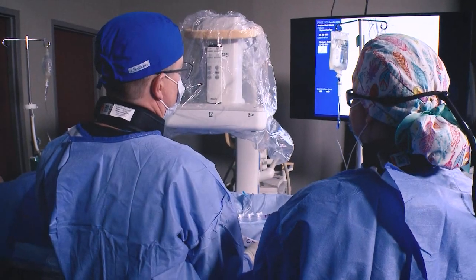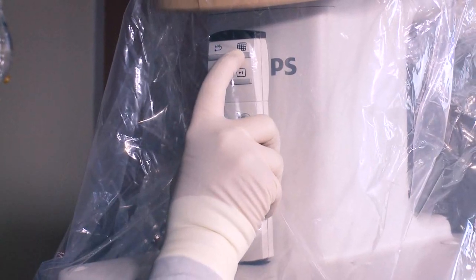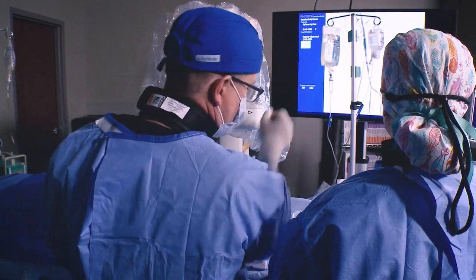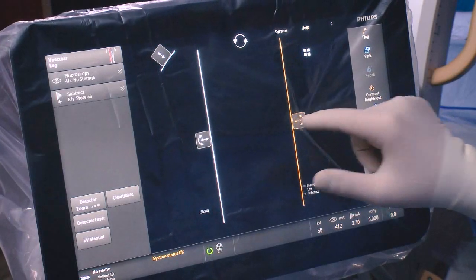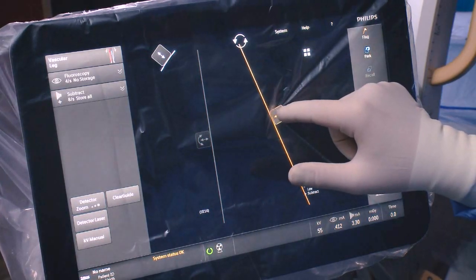We have a convenient remote placed on this part of the C-Arm where I can access and replay images from before, move them forward and backward. The shuttering is easy to manipulate — you can have individual shutters that you can move in and out as you would like, which again allows for better image quality.